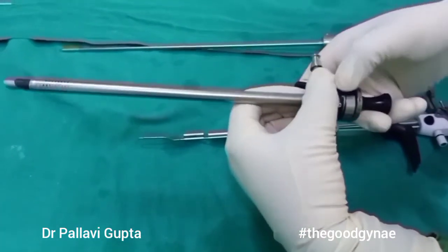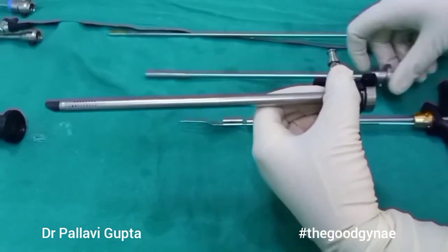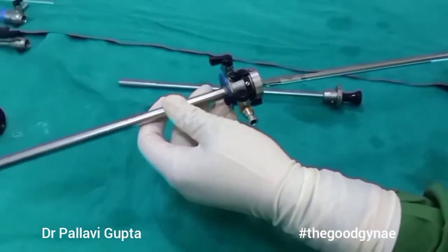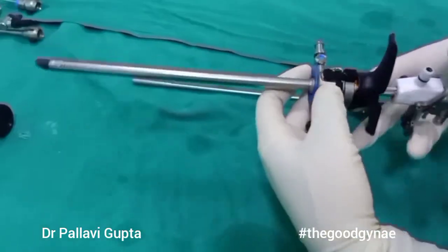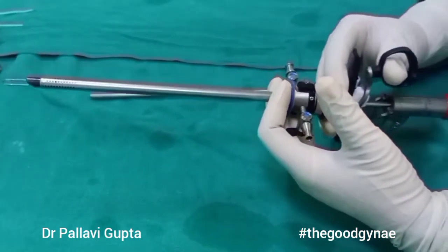When we put these inside the cervix we have to remove the obturator. Once we remove the obturator, the working element can go inside the sheaths. This is locked in place and the handle is moved, which is going to move the resectoscope in and out.